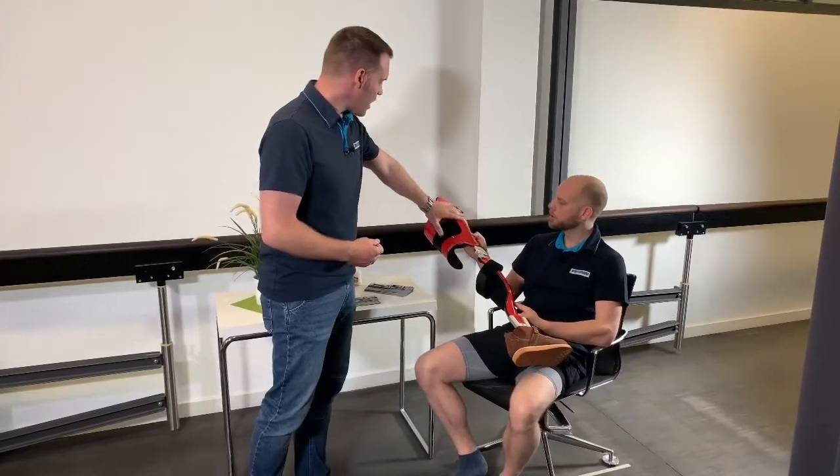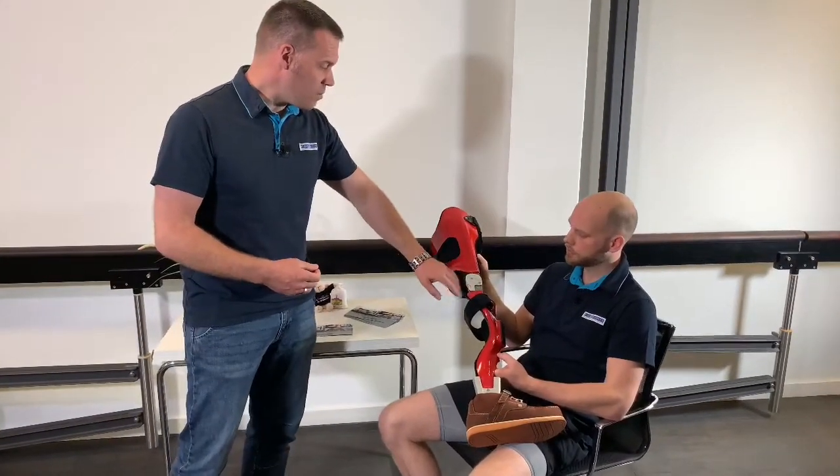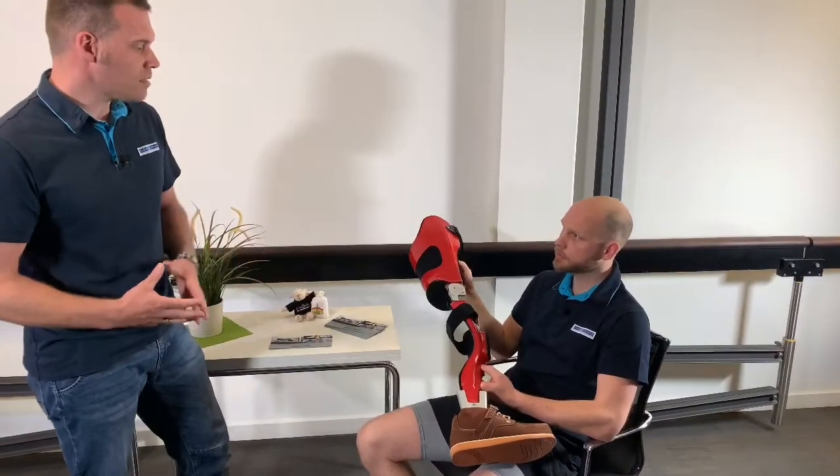The orthosis shells themselves were made of a fiber composite material, mainly carbon fiber. The metal components are made of titanium and aluminum, and so it is possible to provide a very high load-bearing capacity with a very low weight. That sounds good, let's try it on.